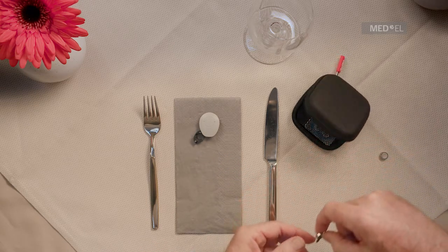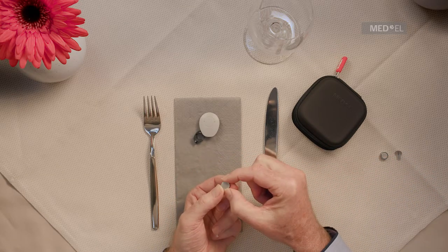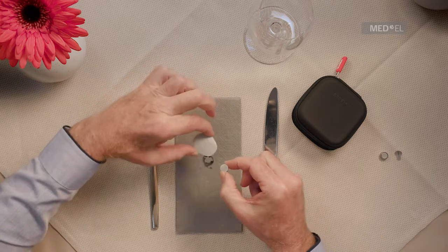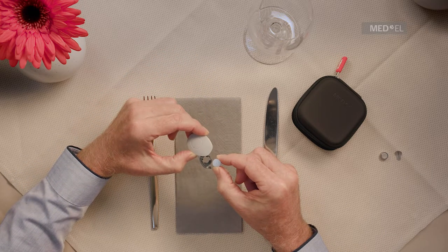Remove the protective film from the new battery. It is recommended to remove the protective film one to two minutes before inserting the battery. This allows the zinc air battery to charge up completely.